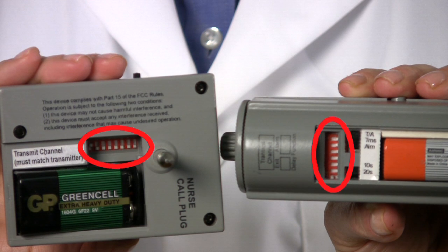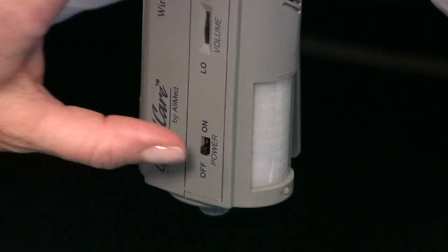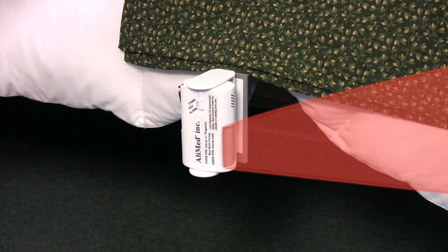Now pair your local PIR unit to the nurse call receiver by matching the DIP switches. Be sure that all eight switches on both units are identical. Once the sensor is securely positioned and DIP switches matched, test it to ensure proper function. First, switch the unit on and adjust the volume slider — the alarm then enters the 10 or 20 second delay mode. Wait for the alarm to beep signifying it is ready, then pass your hand through the sensing field. The alarm will sound.